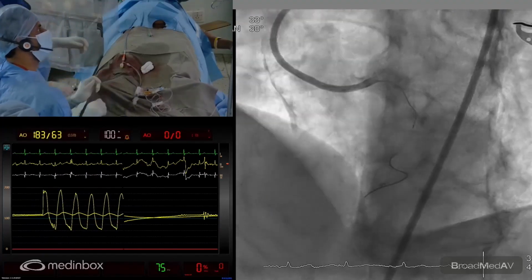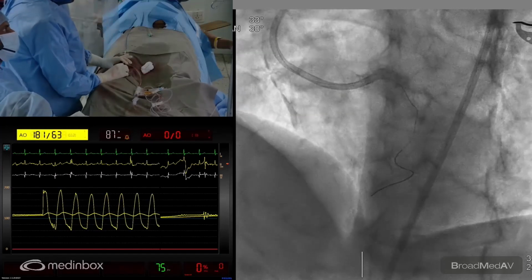So I think we have got a reasonable result. The guiding is inside, but we'll take the IVUS and see. The guiding is not really compromising anything. So we'll get down the IVUS and then pull the guiding out and check the whole stent. The issue is whether we need more. So 4.0 at 24 is how much, sister, please? What is the size at 4.0 24, please? 4.3? Okay, so we have reached 4.3 now.